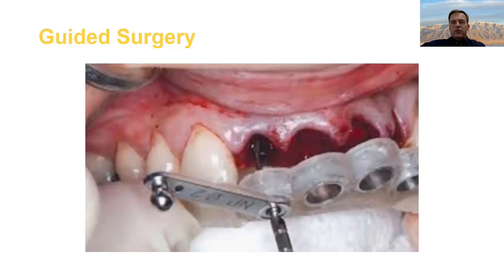And what are the advantages of the CBCT guided surgery? I would say that in terms of actually doing the surgery, it usually goes much quicker than a freehand because you don't usually have to do mid-process scans and the like. If you're doing a single implant or a simple case and you're confident in your guided surgery and your plan, you can do a flapless surgery. So you just use a tissue punch or a crestal incision, and then there's not near as much healing for the patient. But I would say the main advantage is the prosthetic result.